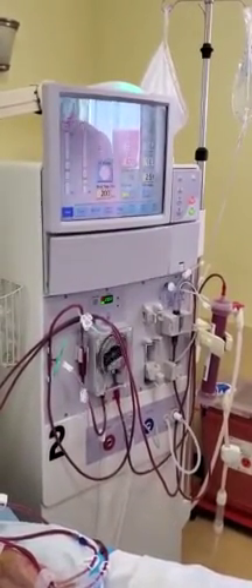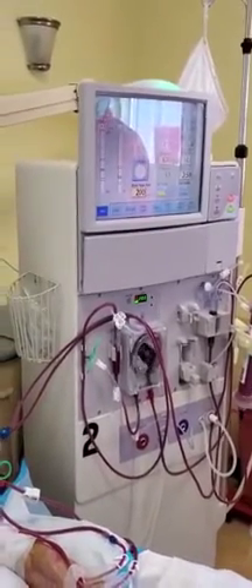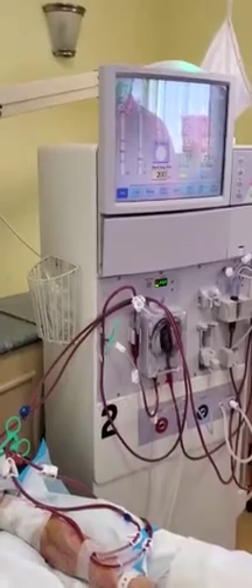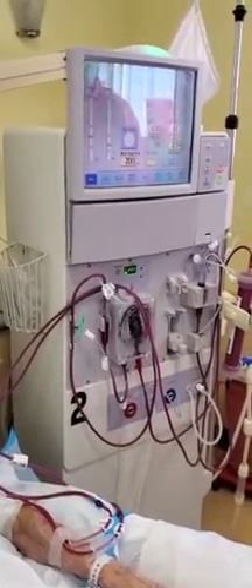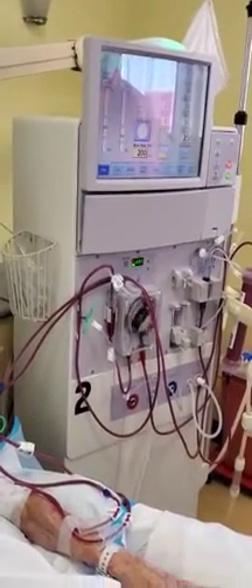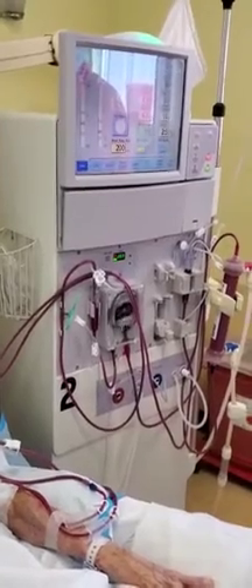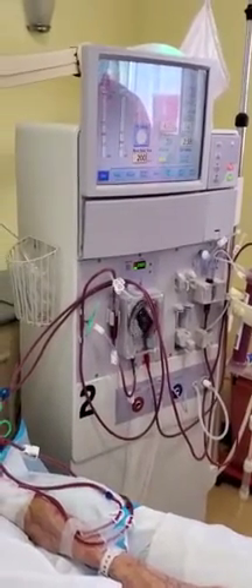Remember, venous pressure measures the pressure in the line where the blood is returning to the patient. That's why you keep your flow at 200 for the first few minutes to do your assessment. If everything is good, then you're going to turn up your blood flow rate to the prescribed flow.